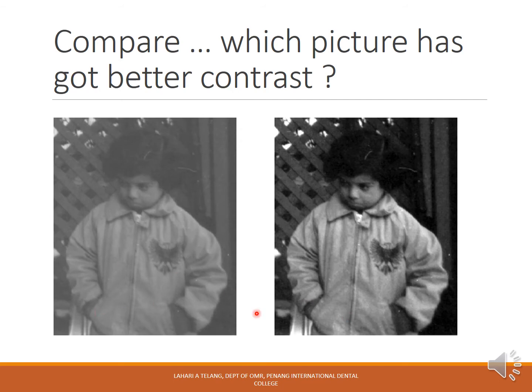If you compare these two photographs over here, you will see that the image on my right side has got better contrast. And why would we say that?